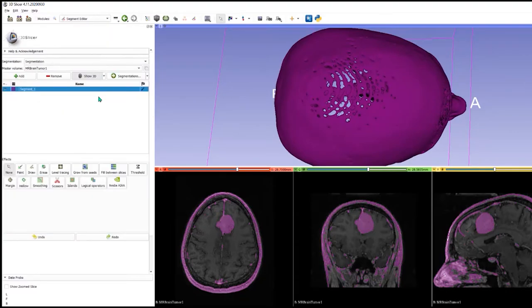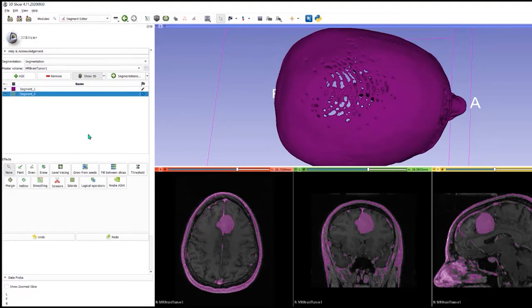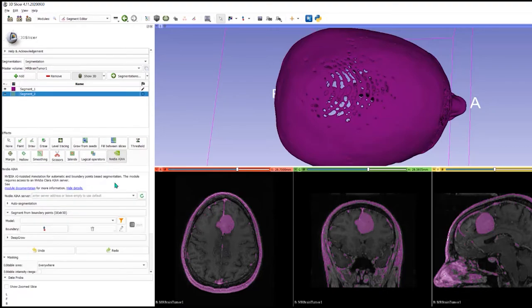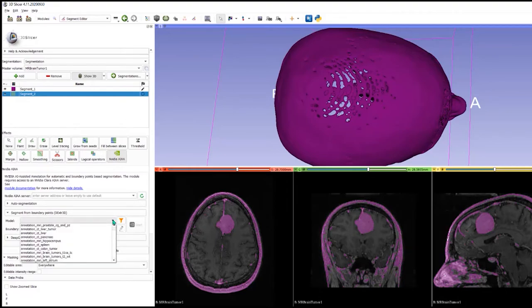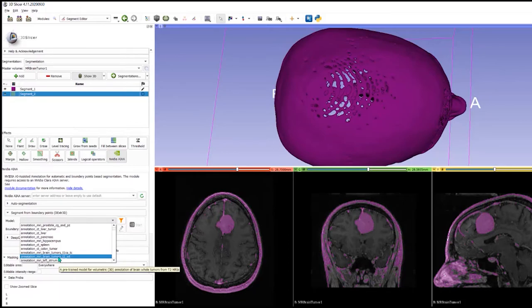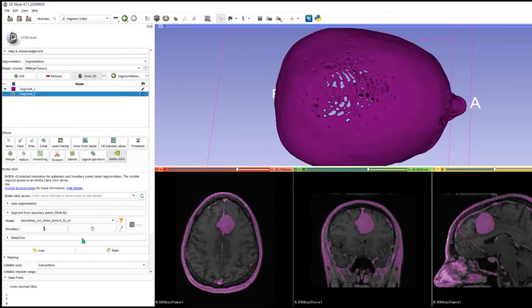If we go into the segment editor, this time we're going to add a new segment but we're going to use the NVIDIA artificial intelligence module. We are going to choose an algorithm which is already trained: the tumor T2.